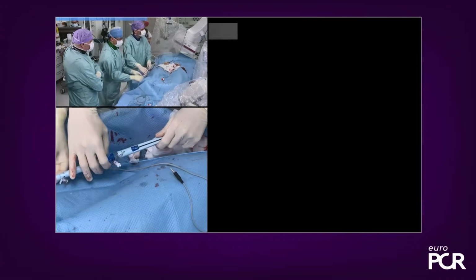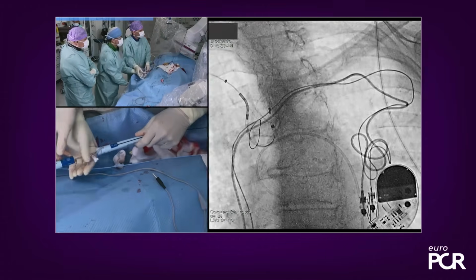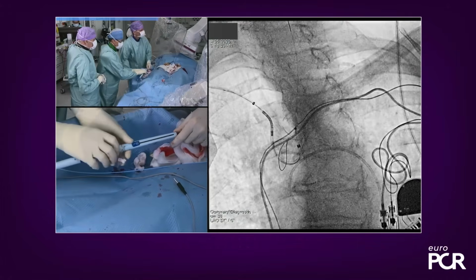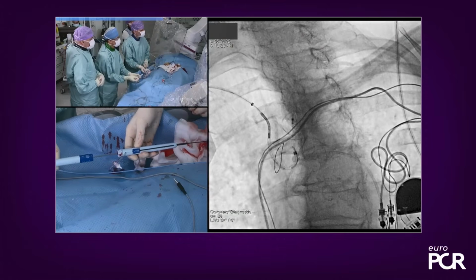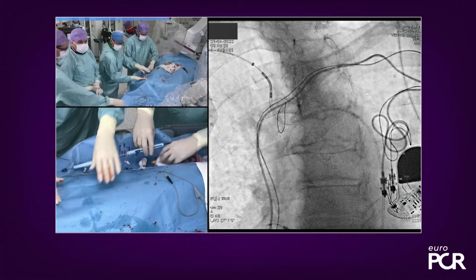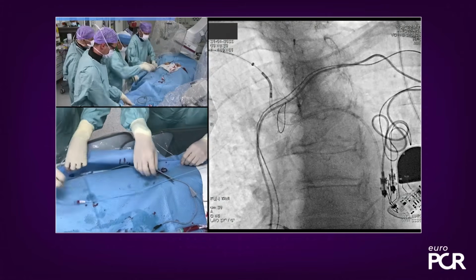And again, recalling how the anatomy was from the CT scan and also looking at this AL1 catheter, Gintas is advancing the wire up to the left common carotid artery. And with this position here, I think you have a nice position, I would guess. Yeah. Can deploy the last one. Gintas is taking knob number 3 here and pushing that forward. That's going to bring the distal filter out in the left common carotid artery. That's it. It's very easy to do, and as you see here, you can do it without any contrast as long as you have your CT scan and a catheter in the arch to have as a landmark.